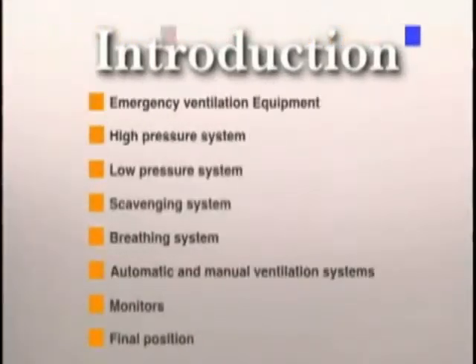Checkout of the following major systems are demonstrated in this video: emergency ventilation equipment, high pressure system, low pressure system, scavenging system, breathing system, automatic and manual ventilation systems, monitors, and checking the final status of the machine.